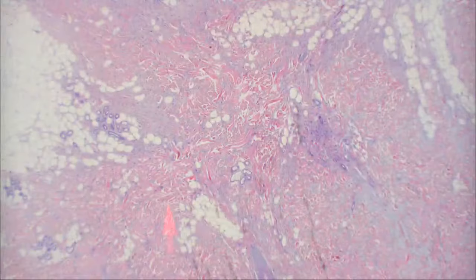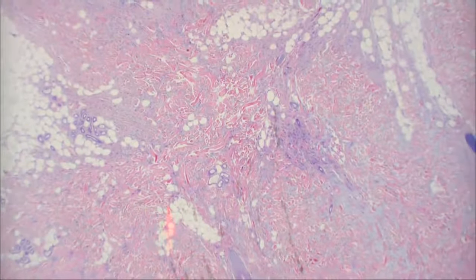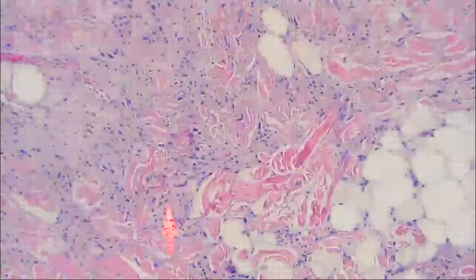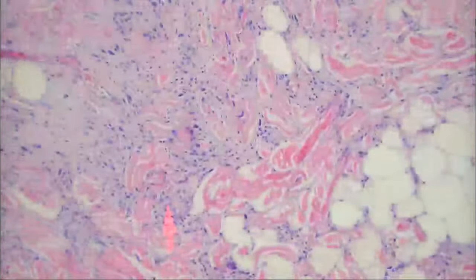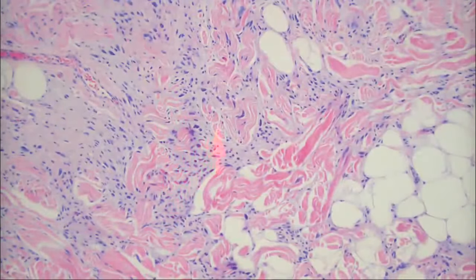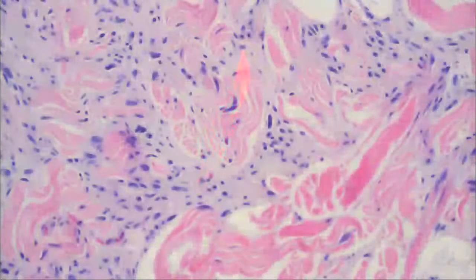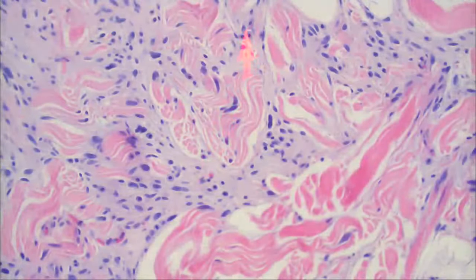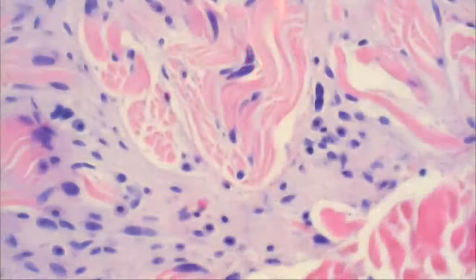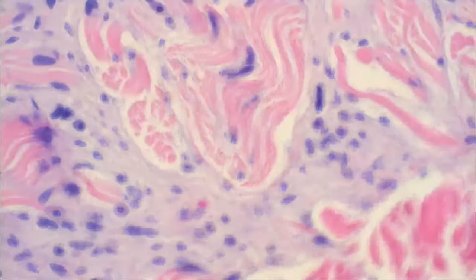Are these inflammatory cells? No, they look more like fibroblasts. Ah. We'll shift gears, maybe to the neoplastic process. There are some inflammatory cells mixed in here, though, interestingly enough. What cell is that right there? That looks like a fibroblast. Or is that a... Try again. Oh, are those mast cells?